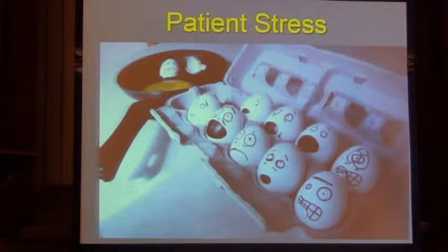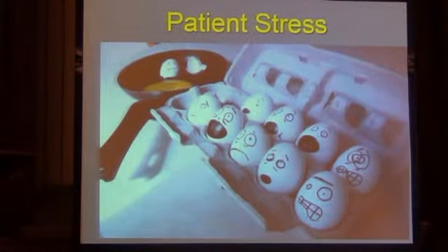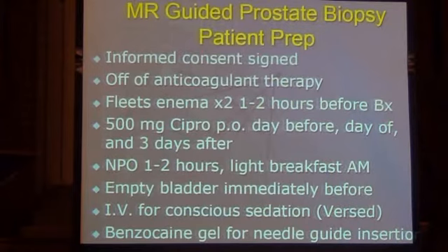Yeah. This is kind of what happens with PSA, right? You got these guys all freaking out that you got something going on, and it's more peace of mind. So a lot of these patients will come in and ask their urologist, you've had 2 shots at this. Isn't there something better than just trying to stab this thing blindly? And they'll refer them to an MRI, because what the MRI does is it gives you peace of mind. You either have something or you don't have something, but you're going to get a definitive answer through MRI. Okay, go ahead.